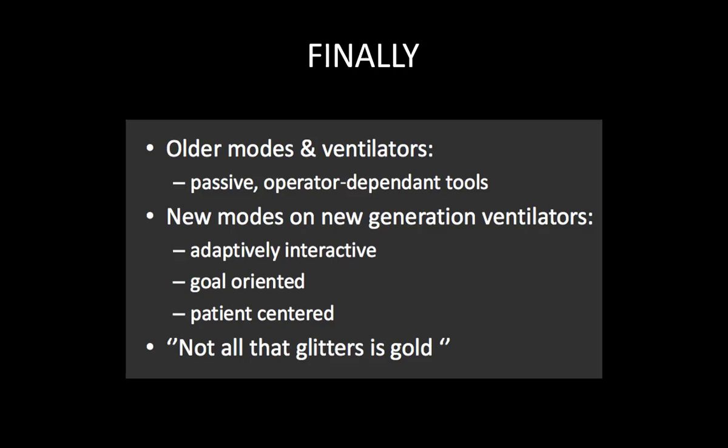So finally, older modes and ventilators are passive, operator-dependent tools. New modes or new generation ventilators are adaptively interactive, goal oriented, and patient centered. But again, there are no studies which show any mortality benefit. So what I say is, it is always like driving a car. You can drive a Maruti, like I am using a WagonR.